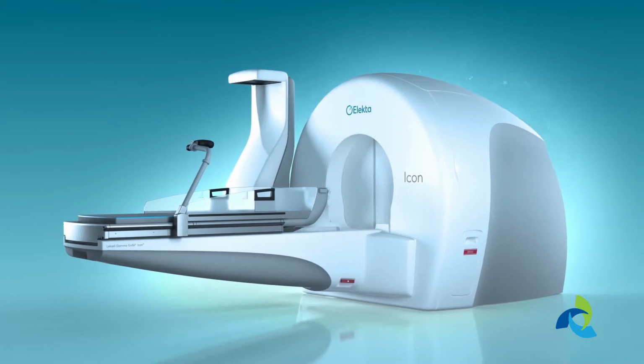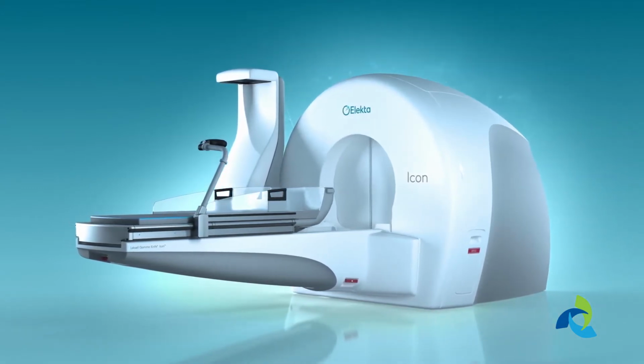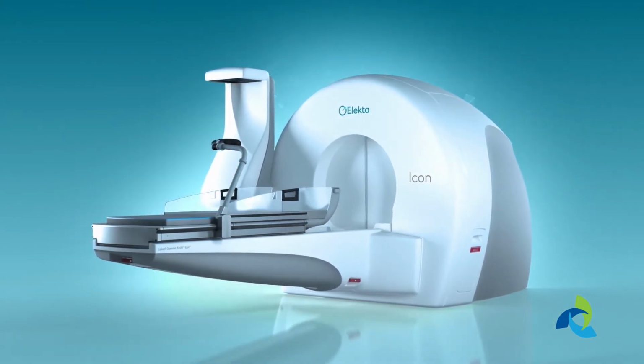Gamma Knife represents a very attractive alternative to whole brain radiation. The treatment is delivered in a single fraction rather than requiring 10 or even 15 radiation treatments. It has far less toxicity than whole brain radiation.